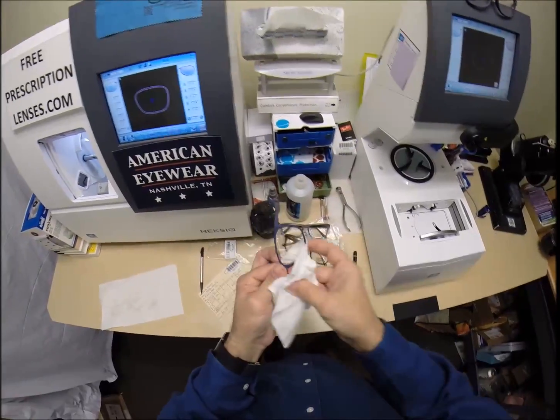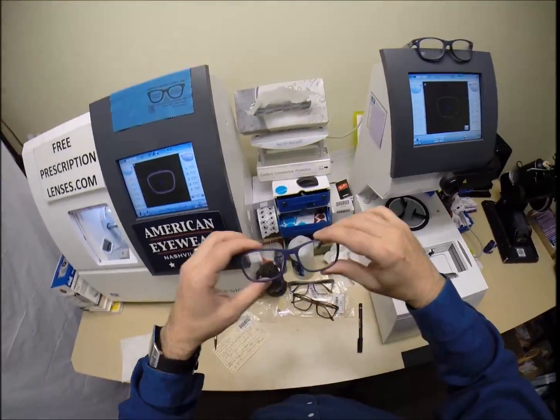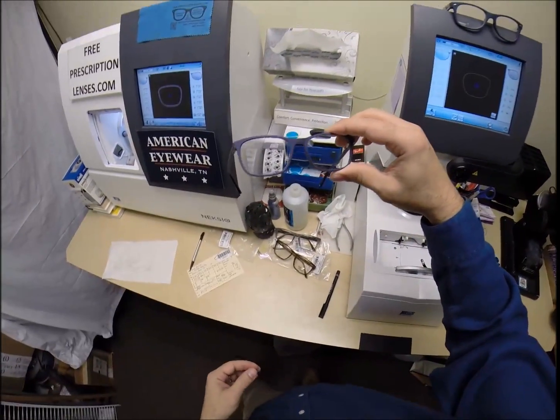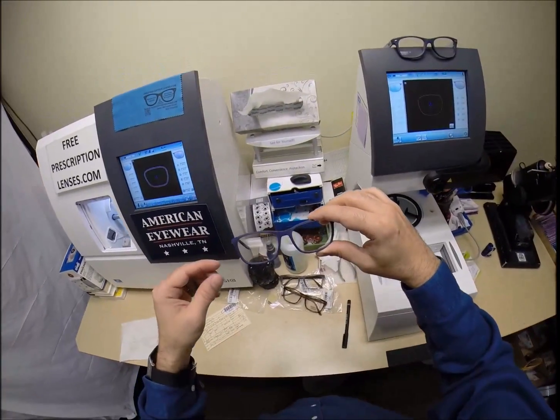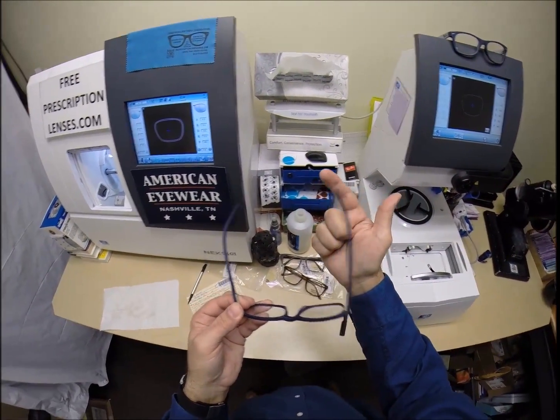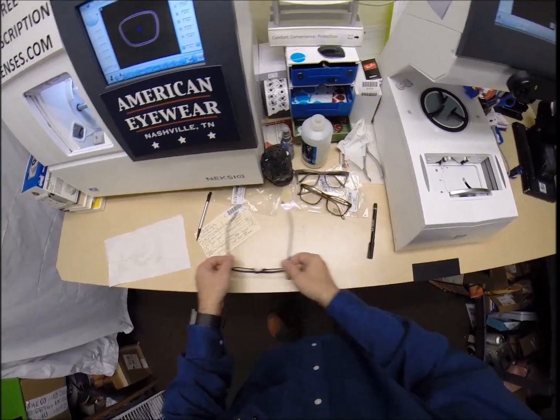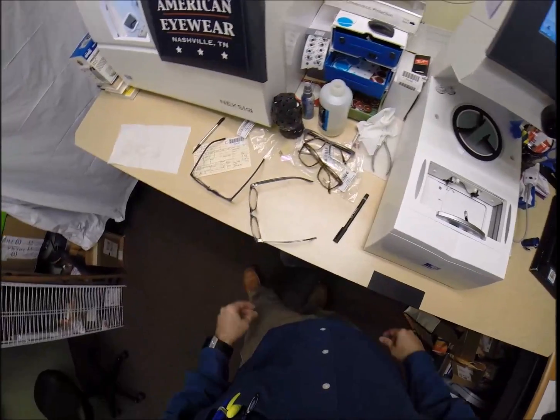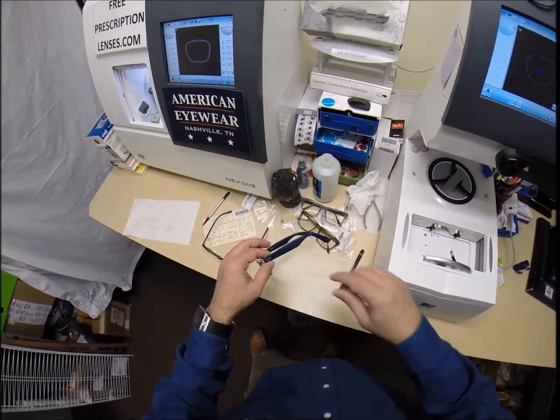But if these are anyone else who gets a pair from me, if they're slightly crooked when you put them on, as I mentioned, 99% of all optical shops will do free adjustments, so just stop by and tell them if it's too loose or too tight, and they'll adjust it for you. But I'm going to get them in standard alignment, also known as a 3-point stance. The 3 points are 1, 2, and the bottom of the frame being 3. I set on the counter and press down. There is no wobble. When I say wobble, I'm part of that 80%. When I take mine off, they wobble on the counter, but they sit level on me.